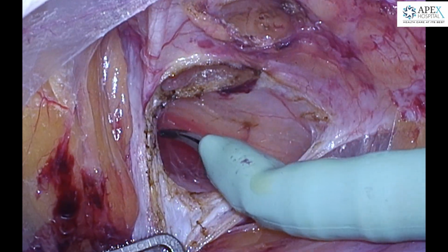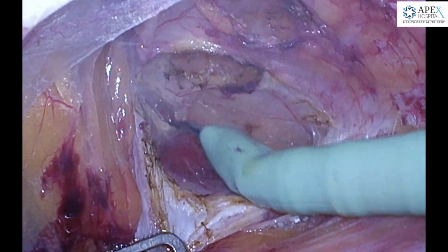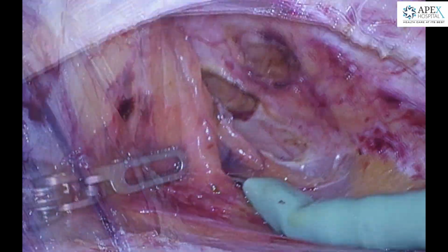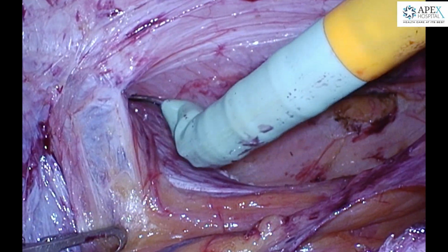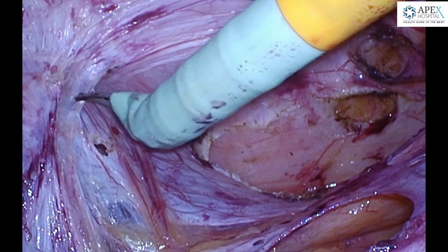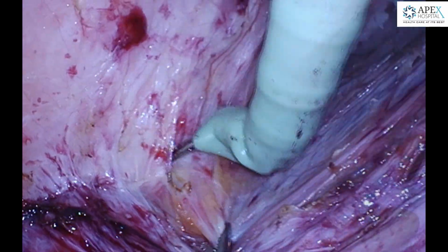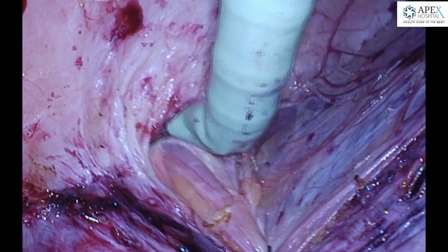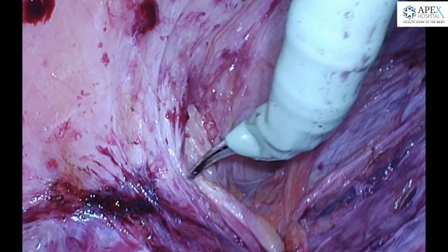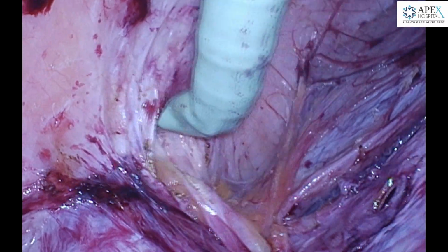This is the right retrorectus space, which is now being developed further caudally to expose the entire divarication as well as the umbilical hernia. The dissection is now being progressed downward, and this is the area of the umbilical hernia where the peritoneum is being reduced from the umbilical swelling.